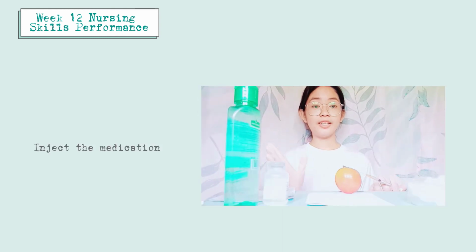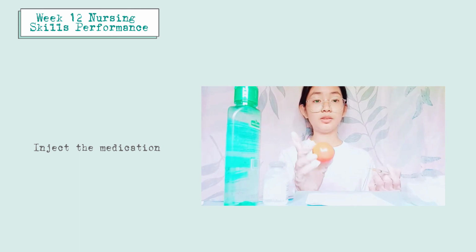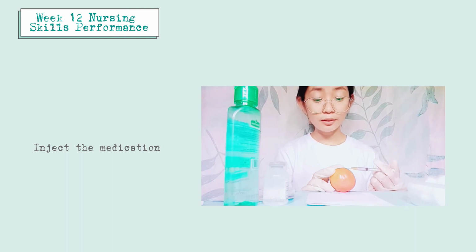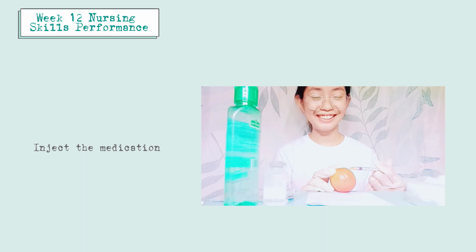Bevel up, and insert the needle at 10 to 15 degrees. Then slowly inject the medication. You'll notice that there is a bleb forming at the tip of the needle. I hope that you can see this.